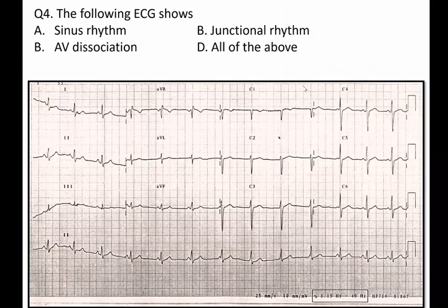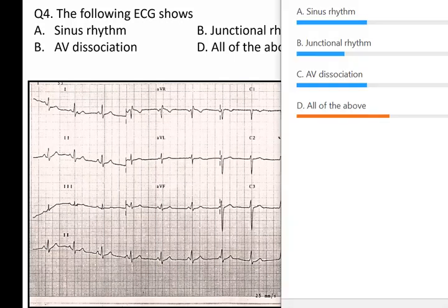So let's have the answer now. Again, it's a mixed choice, but the correct answer is all of the above.